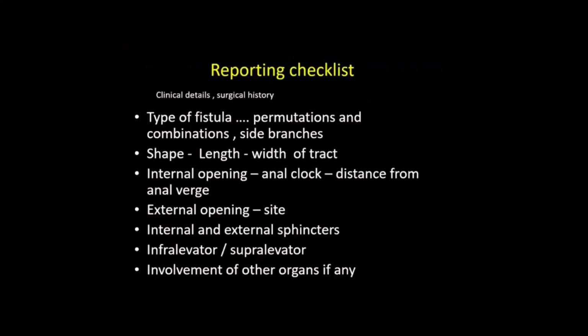You have to give information which is very essential. Now we are slowly moving from didactic reports to structured reports. The surgeon doesn't want a full page of paragraph, the study shows evidence of one blah blah blah. No, you just give them what they want. You give them the external opening, you give them the internal opening, you give them the length of the tract, the nature of the tract, whether there is ramification or not, whether there is associated abscess or not, what is the distance of the internal opening from the anal verge, right? Whether the tract is infralevator, supralevator, whether it is involving other organs, and he is happy.